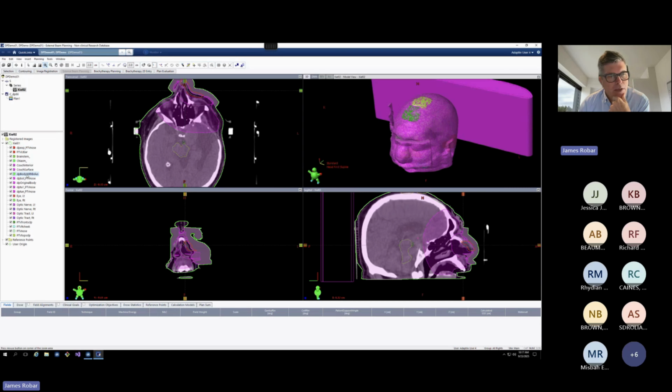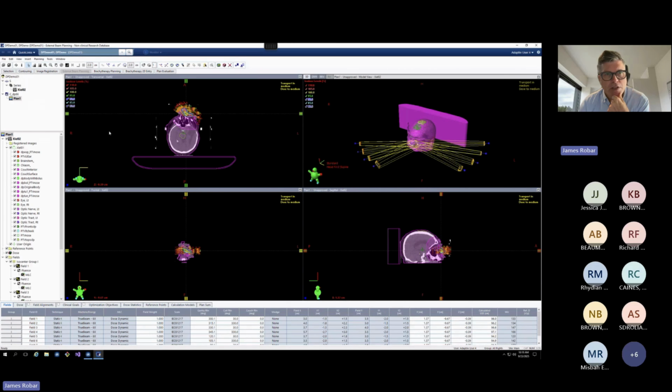We have a body that now contains the bolus, so it will be included in the volume dose calculation, although we preserve the user's original body. People would get angry with us if we disposed of that. And then tuning structures to use in the optimization.